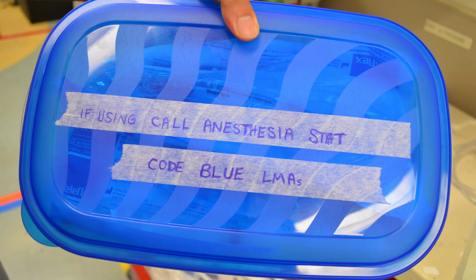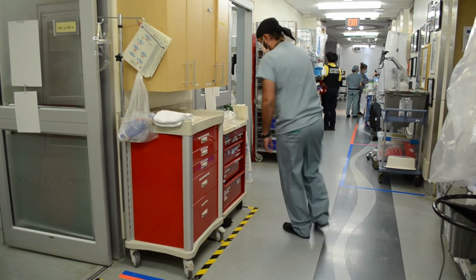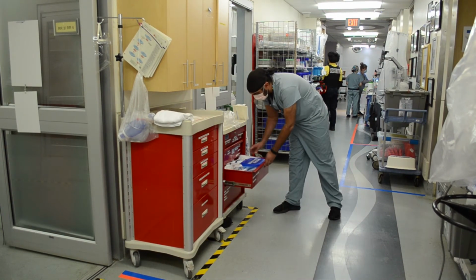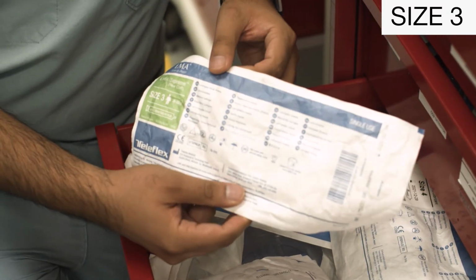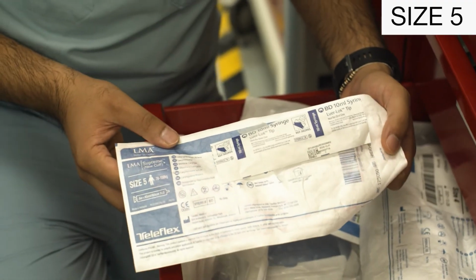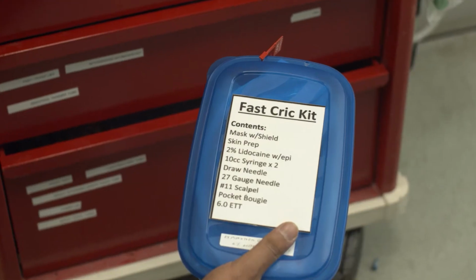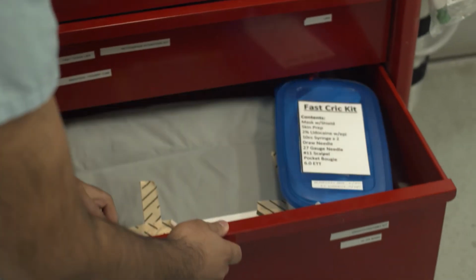Plan B for rapid sequence intubation involves a laryngeal mask airway. Our LMAs are stored in a kit in the 3rd drawer of the difficult airway cart outside resus 3. Use a size 3 for small adults, size 4 for normal sized adults, and a size 5 for very large adults. Plan C is a front of the neck airway or cricothyrotomy, and our fast cric kit is found in the bottom drawer of the cart.